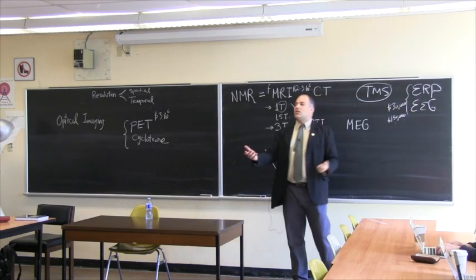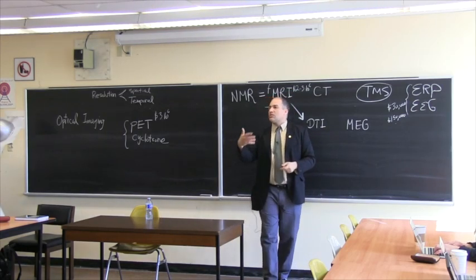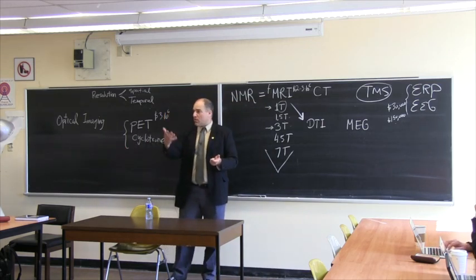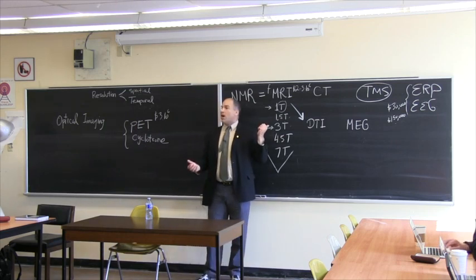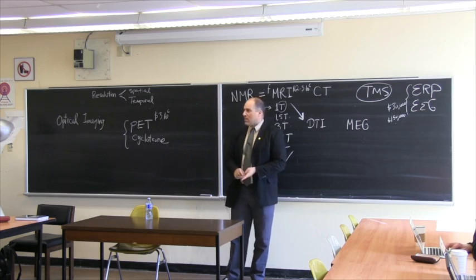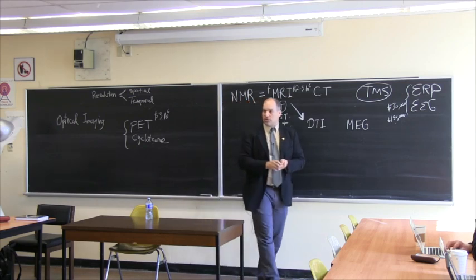So the technology is beginning to get more and more mobile, lighter, smaller, and it allows us to collect this information from people in a non-invasive, or relatively non-invasive, fashion, which is very important for field studies. Today, EEG systems are very mobile. You take a suitcase or two with some batteries, amplifiers and electrodes, and you're all set. You collect the data, go back to your lab, analyze it for a few months, and you have the results.